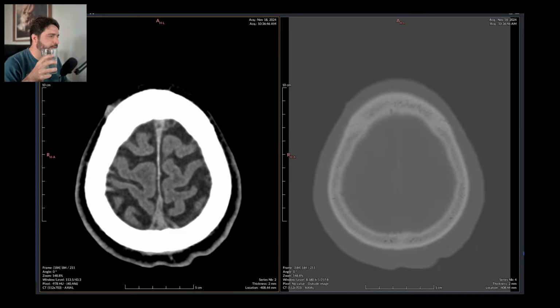If a doctor refers a patient to get a brain MRI because of memory loss, is it a good idea to also include T2 thin coronal hypothalamus slices, or is it irregular T2? If it says memory loss, you surely should get a coronal T2 for hippocampus, not hypothalamus. I suppose you meant hippocampus.